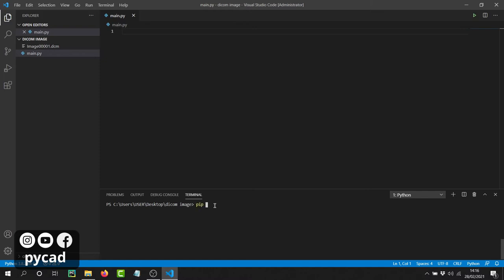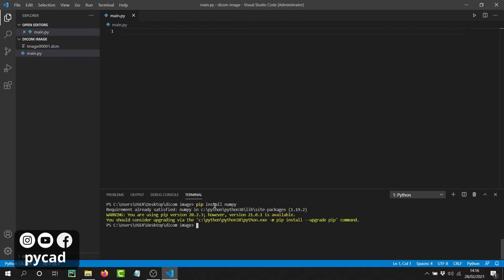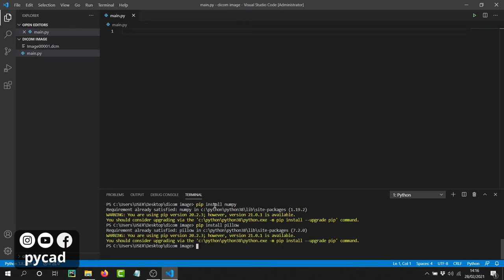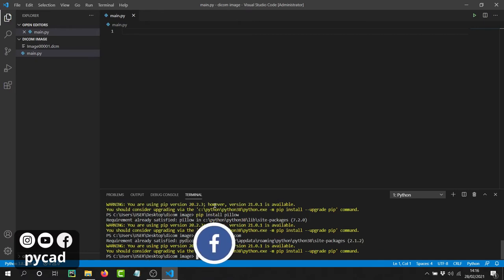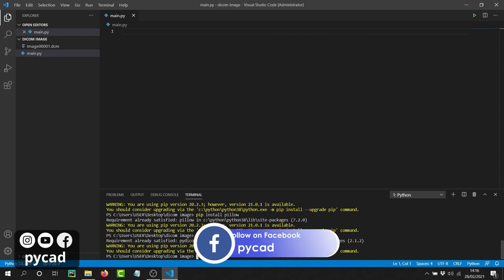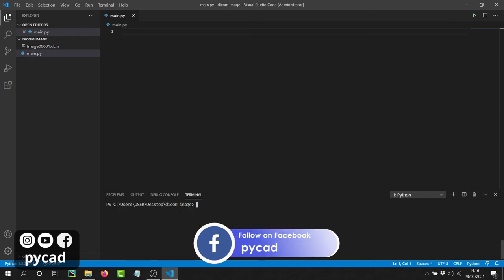The first one is numpy. For example, `pip install numpy` — I have already installed this library so I don't have to install it again. The second one is Pillow, which I also already have. The third one is pydicom. So we have to install these three libraries.